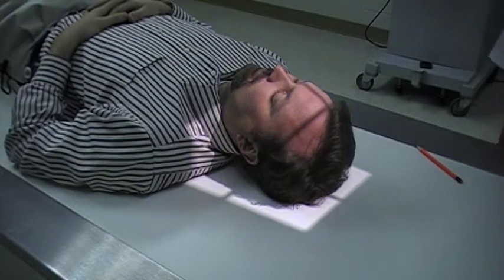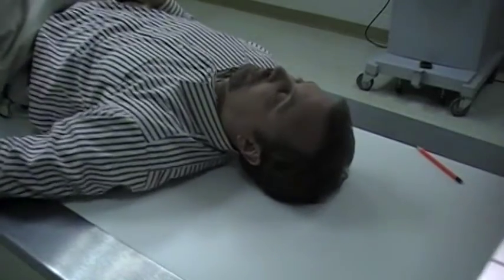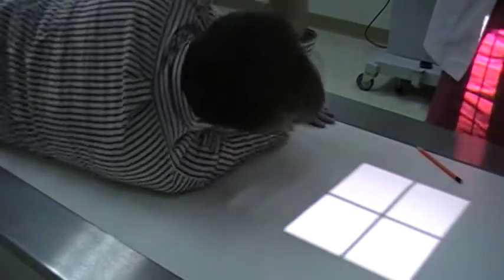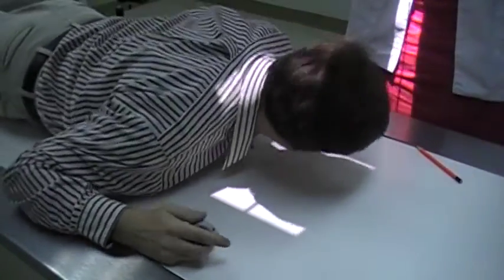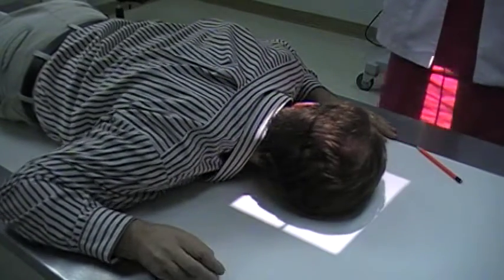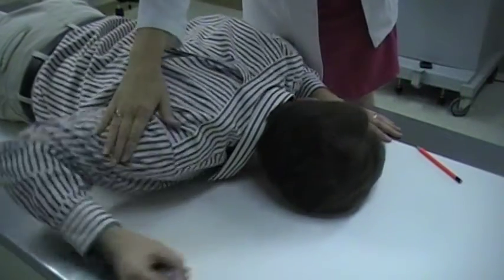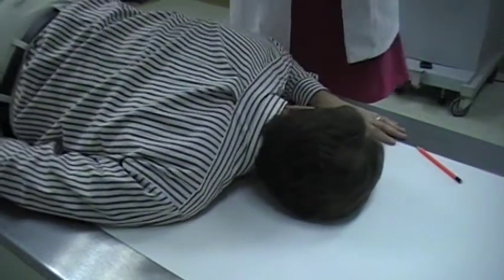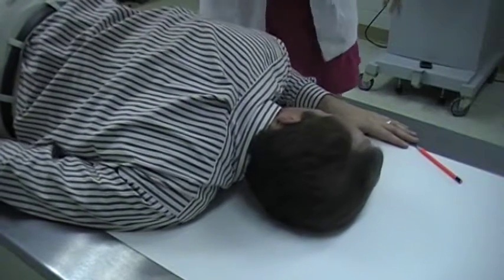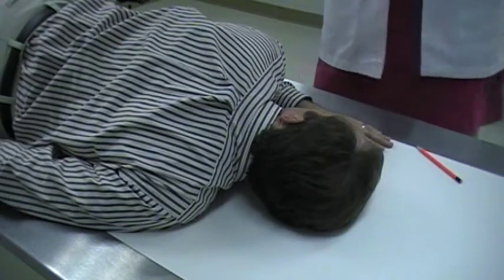Okay, next we're going to go do our laterals. Do right and left lateral. Have your patient prone, and we're going to do the right lateral first. So I'm going to put the right arm down by patient's side. Put this right arm down. Going to roll onto the right side and going to have this left hand up in front of the face.